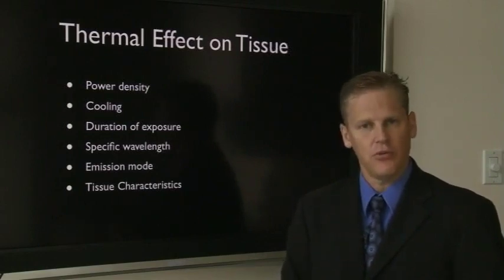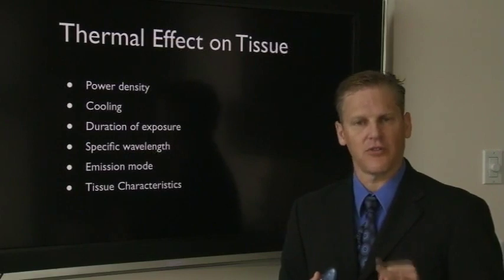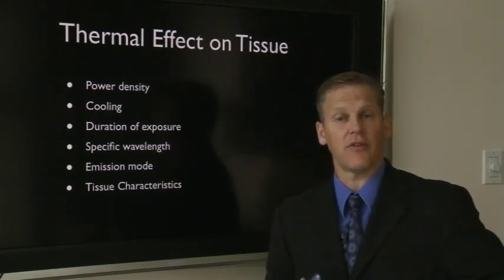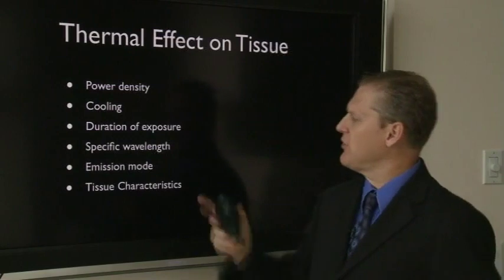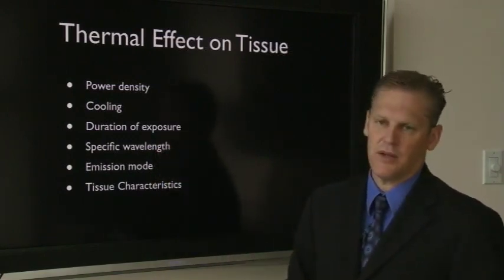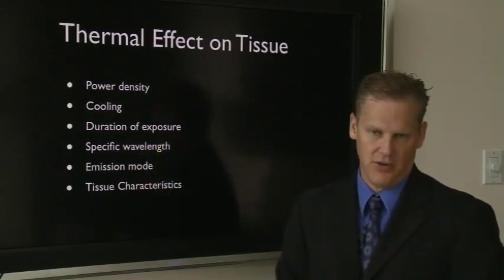Erbium and CO2 lasers, CO2 is a soft tissue laser, erbium is a hard tissue laser, they have a very limited depth of penetration. Nd:YAG, which is a soft tissue laser, can penetrate deeper, 4 millimeters or so, whereas a diode laser is in between. So again, the depth of penetration can affect deeper tissue levels, and that's why the different wavelengths have different penetration levels.